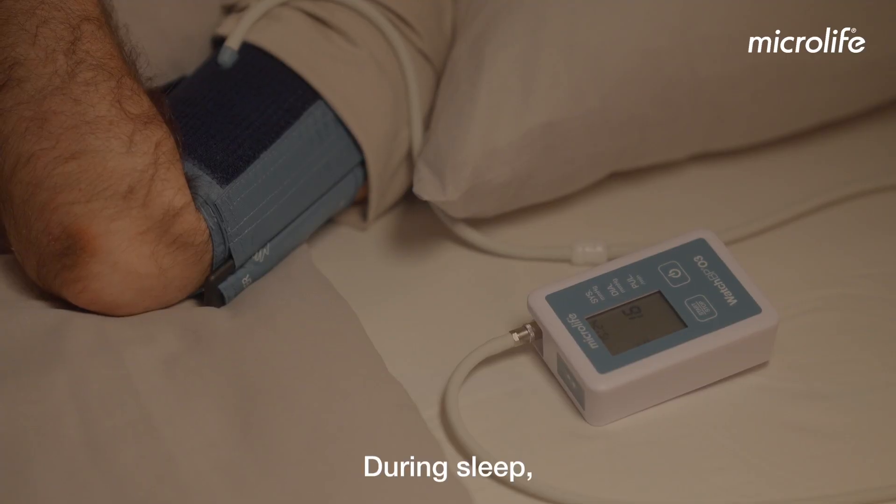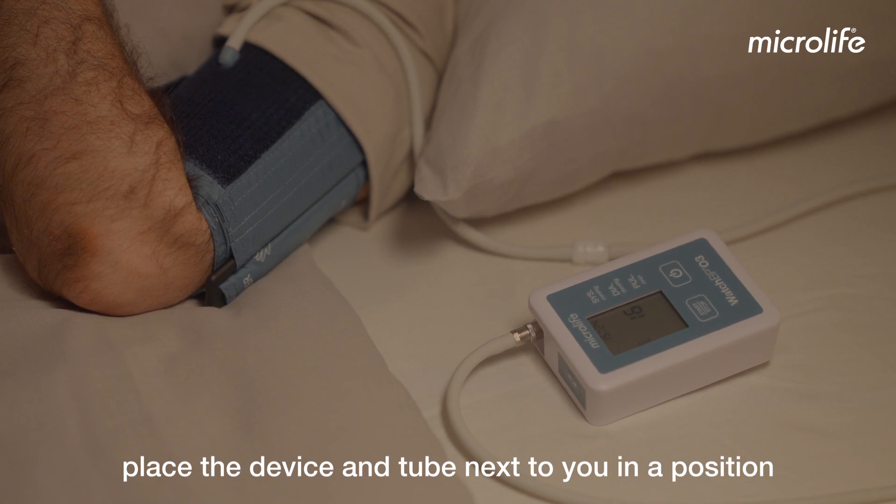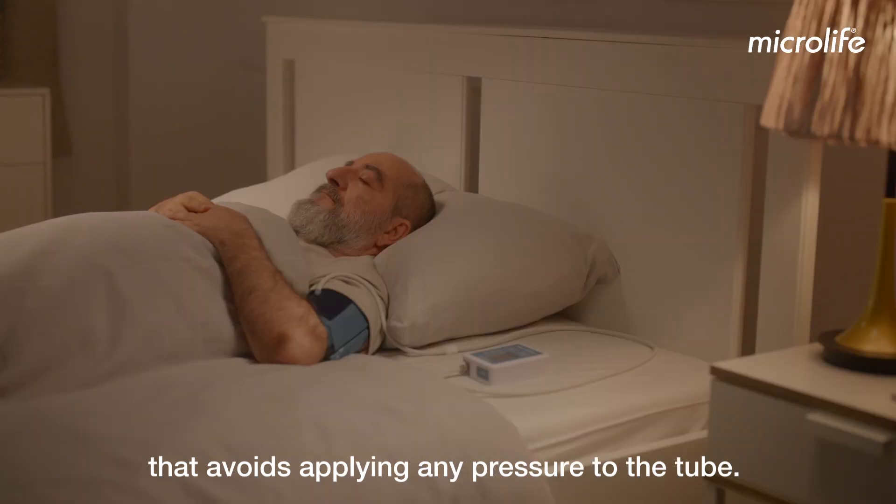During sleep, place the device and tube next to you in a position that avoids applying any pressure to the tube.